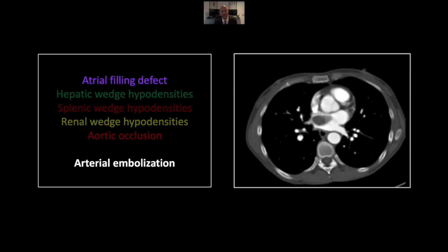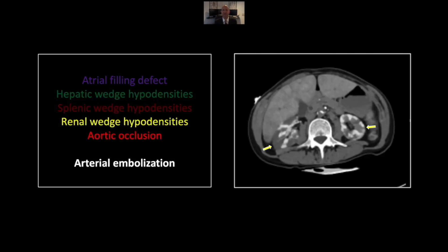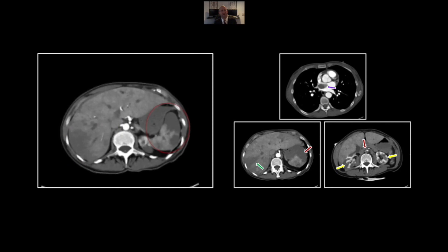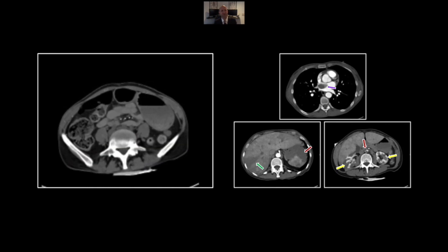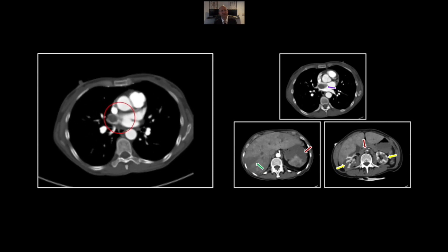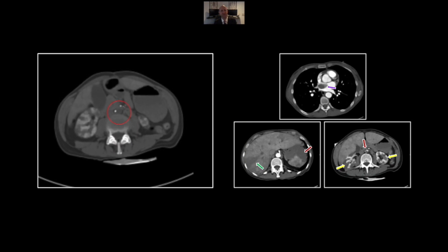Our last case in this session is one of distal arterial embolization related to an atrial mass. There is a hypodense filling defect in the left atrium, which is the source of all the embolic phenomena we will see in the abdomen: hypodensities of the liver, the spleen, and the kidneys — all characteristic of arterial embolization. Note also the occlusion of the distal aorta. There are all those embolic phenomena, and the source of it all is a large right lung mass extending down the pulmonary veins into the atrium, ultimately causing occlusion of the distal aorta and resulting in distal embolization.